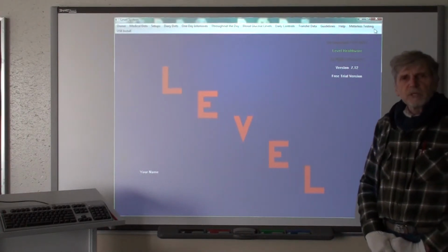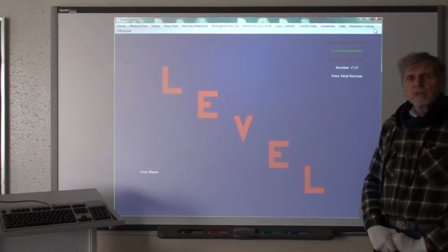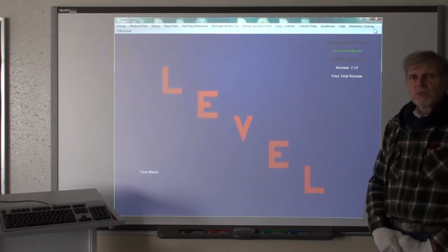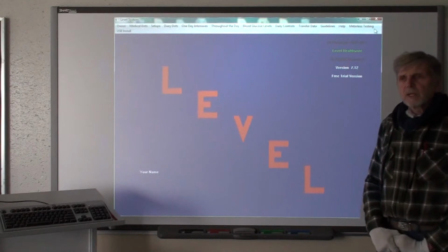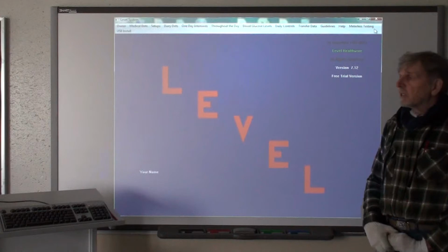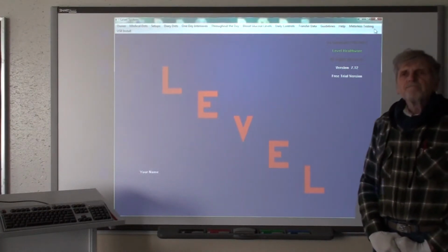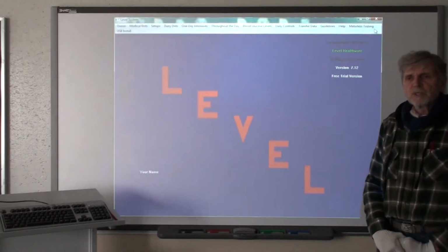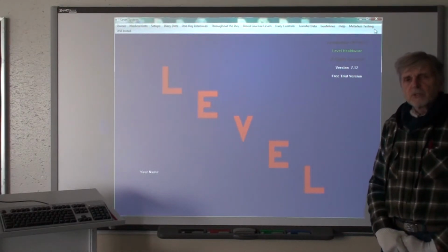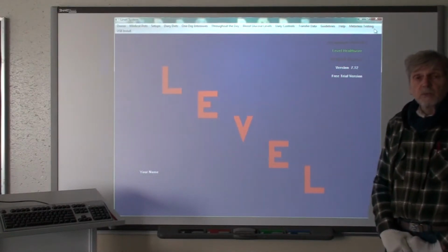We approach it so that there is also a copy in your computer, so that if the internet is shut down or you don't have access to it, you can continue on your computer in standalone operation. Also, you have control of where that location is on the internet. And if you decide to change to another location, then it is very, very easily done also. This suggested Yahoo Small Business web hosting website can service up to 200 patients. So it is a bit wasted if you get one entirely for yourself, although that's certainly a good way to do it.